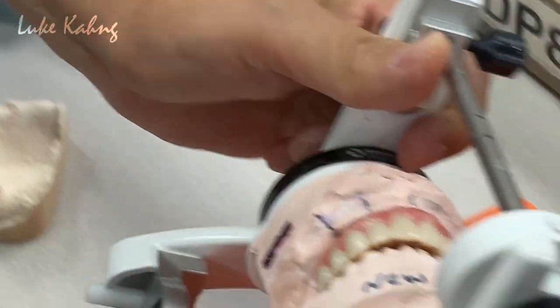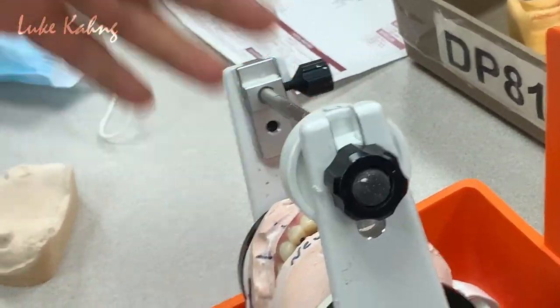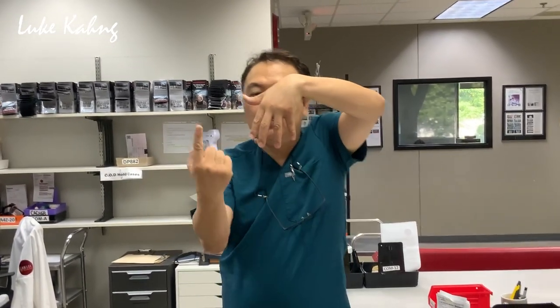So what I'm going to do, I'm going to take the shot. Here is a huge problem. Now, here we're going to confuse. These teeth already have good aesthetics. I'm talking about not this. So they've got anterior, they've got good lip support. I cannot bring it in like this because they're happy. I wish I could see the patient here so I could tell if I can put it in there. Here it's bulky, it's too thick. Okay, I can bring it in, bring it down. But here is the problem.